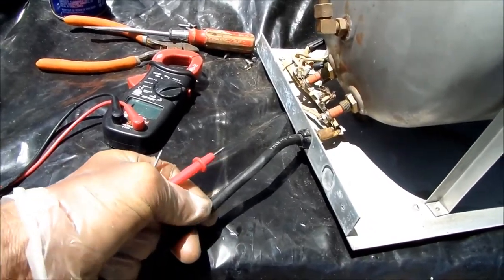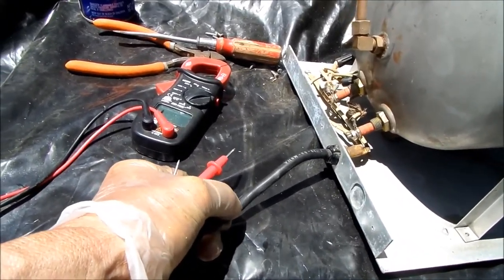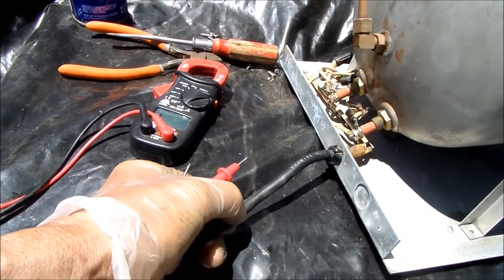The next thing we want to do is check the continuity on the power line to make sure we're getting power up to the switch.